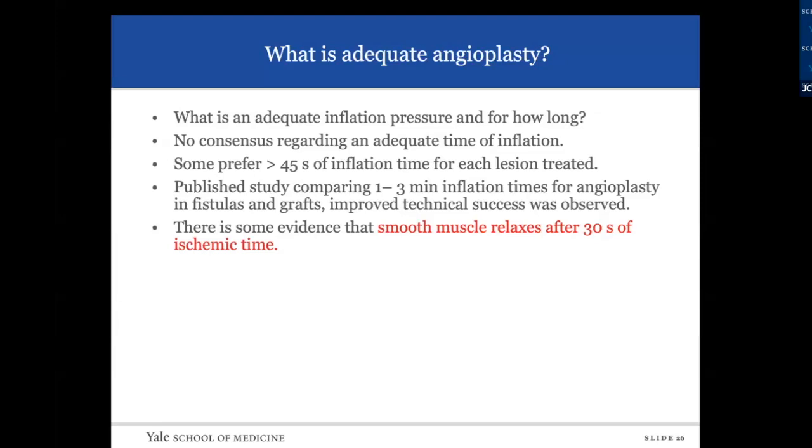At this point, you do a lot of them and you kind of gauge what size the fistula is. But if you're starting to do fistulas, start from something smaller in size to something bigger in size. Patients that I have treated with 8 or 10 millimeter balloons, now I know that I can put the 10 millimeter balloon right from the get-go, and I don't have to go in increments. But at this point, you kind of gauge what it is.